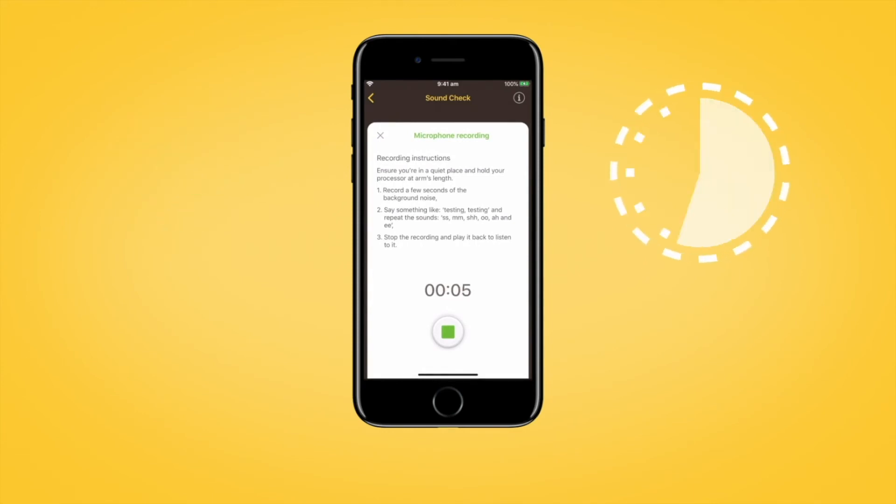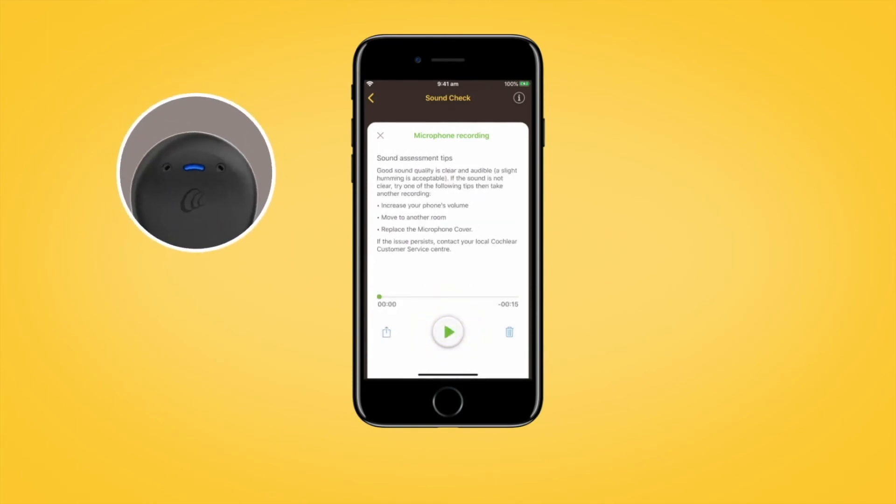The maximum recording time is 30 seconds and the elapsed recording time will appear on screen. Tap the Stop button to finish recording. The recipient will hear the sound processor beep at the end of the recording.